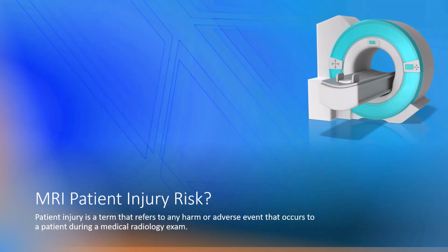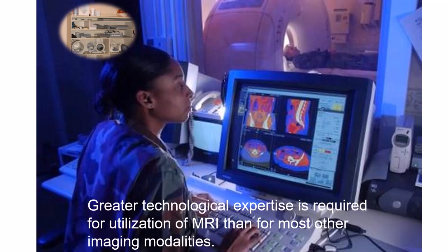When we substitute the X-ray for a radio frequency wave, then we don't have any problems with ionizing radiation, right? That's true, but now we have to worry if our patient is at risk using magnetic resonance imaging techniques and equipment. Greater technological expertise is required for utilization of MRI than for most other imaging modalities. And yes, there is patient risk involved with an examination, and we'll look at highlights of that in this presentation.